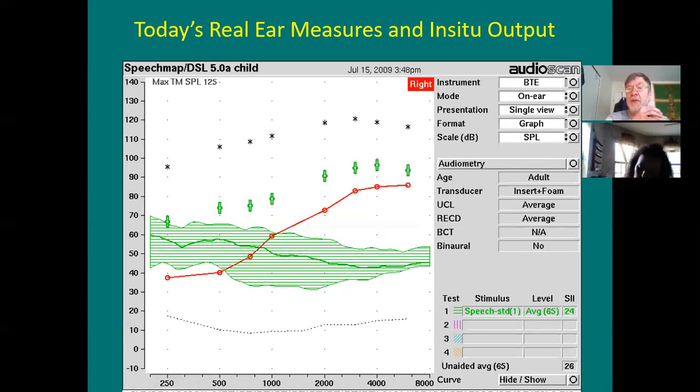And no hearing aid was worn by this person. And so therefore, only the parts of speech that are audible are the low-frequency vowels on the left. The high-frequency consonants literally fall below the guy's threshold, so he can't hear them. So now you have a tool for counseling.